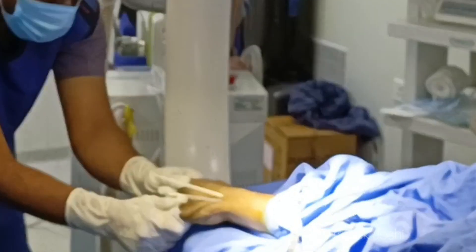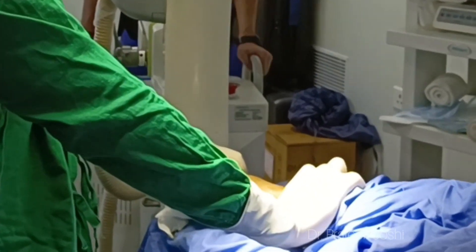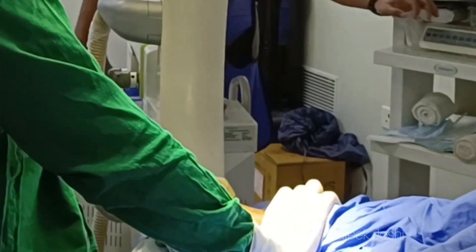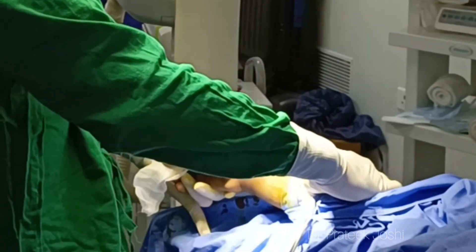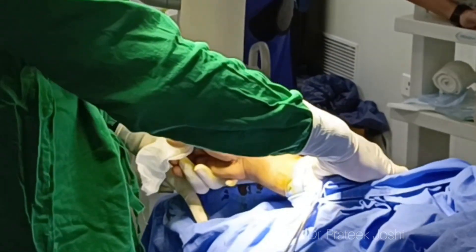We have inserted our second K-wire. I am checking the position of the wire and reduction of the fracture in both PA and lateral views, and I am satisfied with the position of the wire as well as the reduction of the fracture.